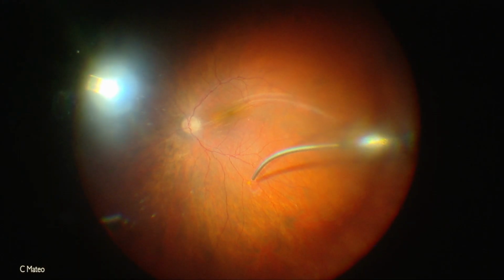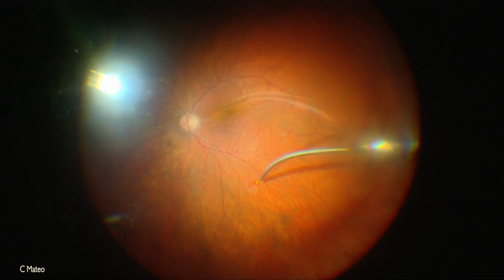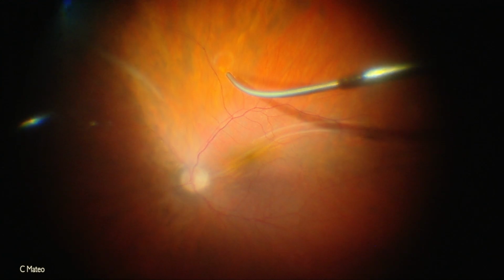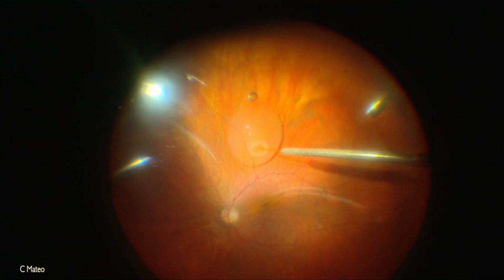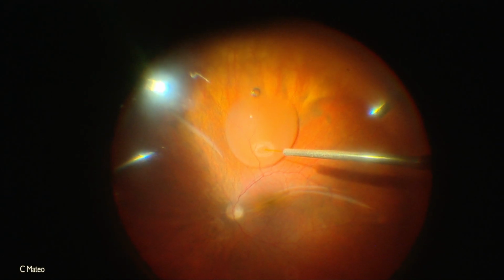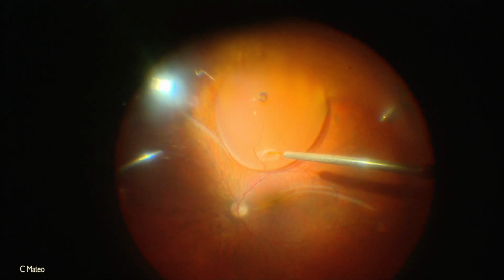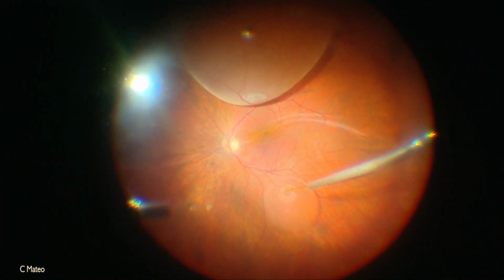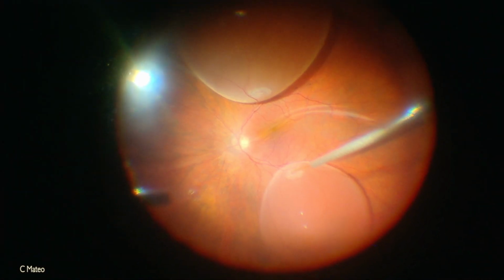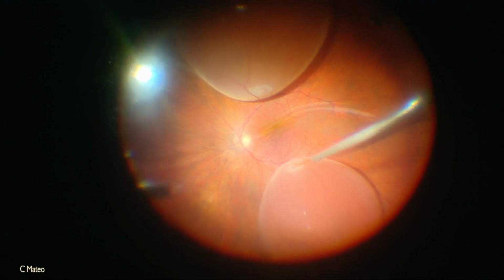Although it's not necessary, I prefer to mark with laser the places where we are going to inject fluid into the subretinal space, using a 41 gauge cannula connected to the viscous fluid injector. Where to inject? I prefer the mid-periphery, far enough from the foveal center where the retina is thinner, to decrease the risk of producing a macular hole. Two injection sites are enough in the majority of cases.